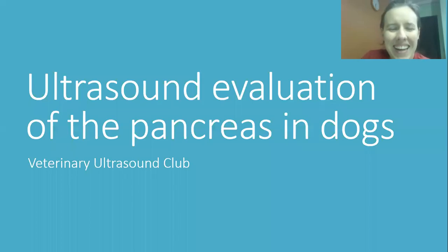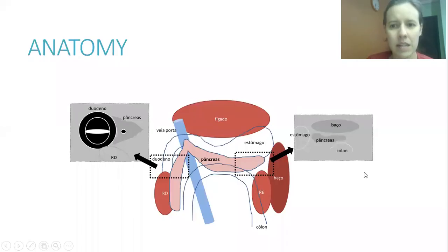Hello everybody, I am inviting you to join me to see this video about the pancreas — specifically the ultrasound evaluation of the pancreas. The first thing I would like to show you is a little bit of the anatomy. This is important when evaluating the pancreas, to remember the landmarks and where it is located in order to find it more accurately.